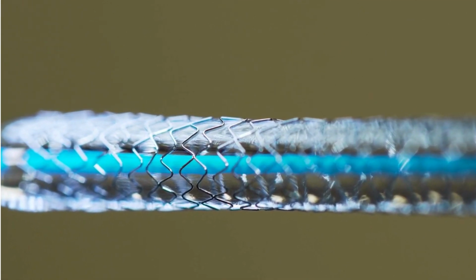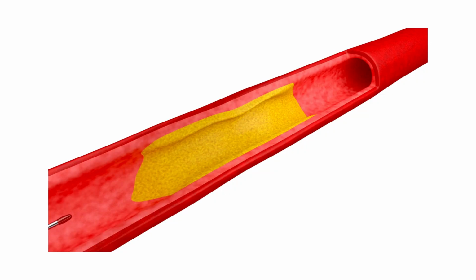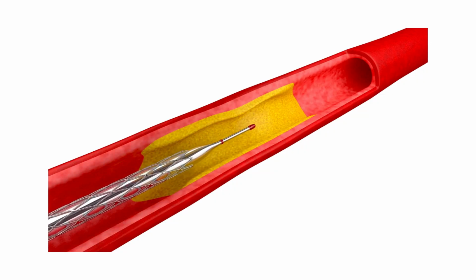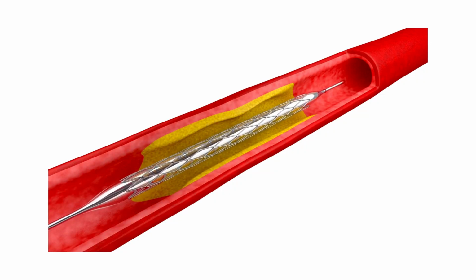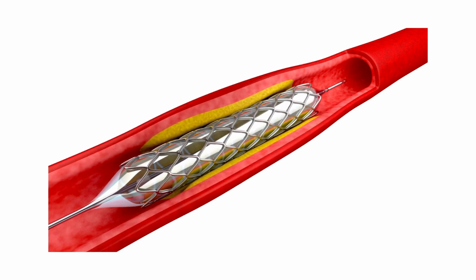Advantages: allows for minimally invasive diagnostic and therapeutic procedures. Provides real-time imaging of the cardiovascular system. Shorter recovery times compared to traditional open-heart surgery.